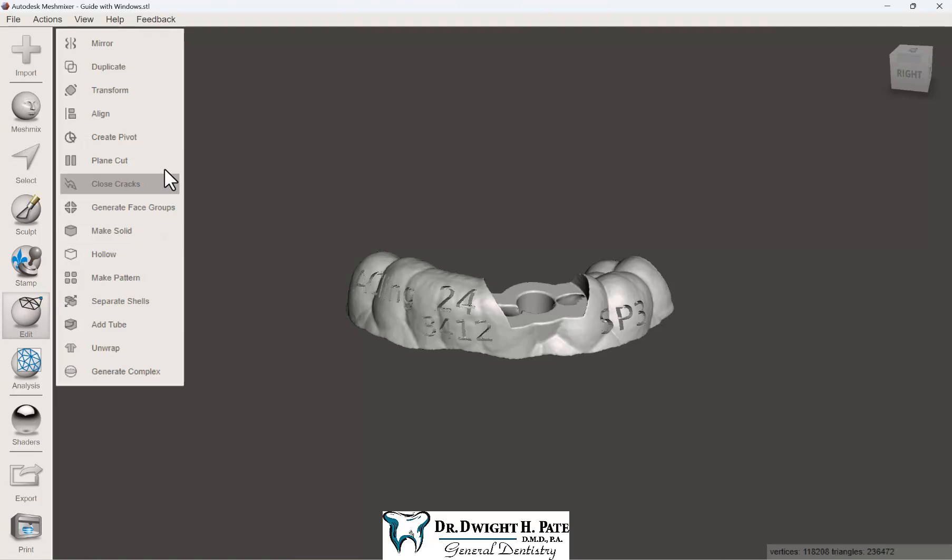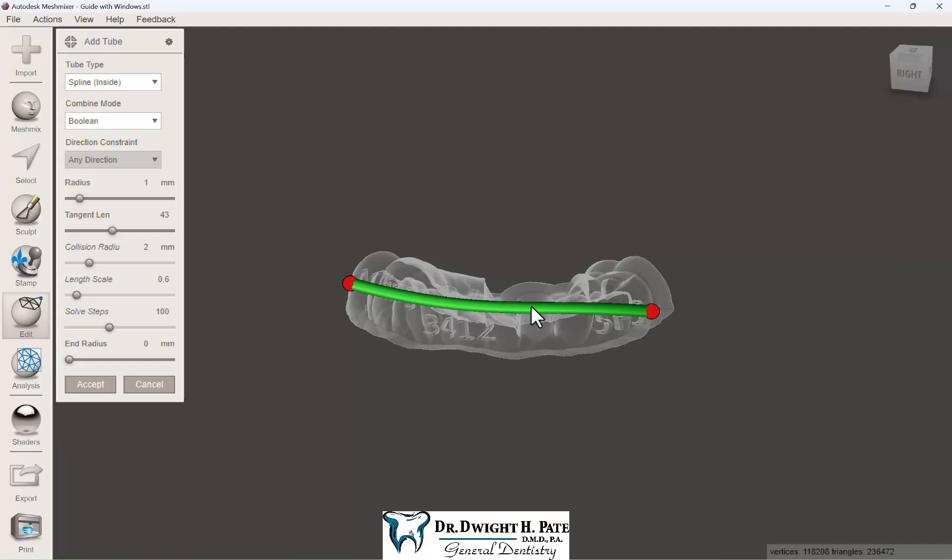In Meshmixer, under the edit button, there's a feature called Add Tubes. When you select that, you've got various options. Spline Inside is the most important one - just match your selections to what I have here.